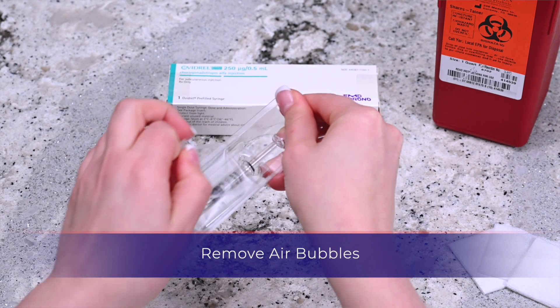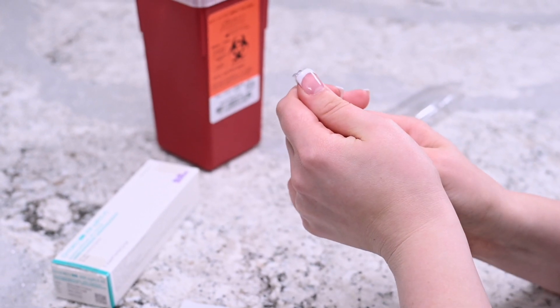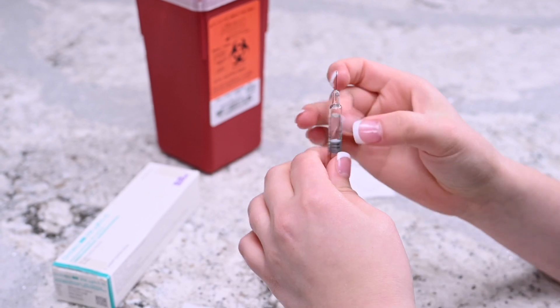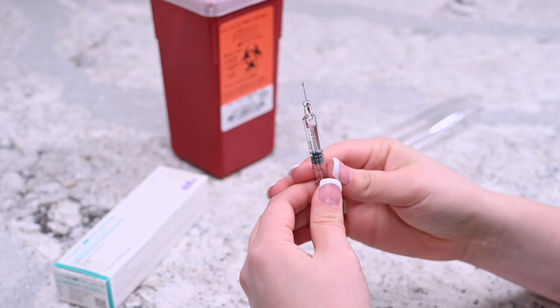Remove the pre-filled syringe from the plastic holder. Hold the needle upright and remove the cap. Don't let the needle touch anything, including your hands. While holding the needle upright, gently tap the side of the syringe until the air bubbles migrate to the top.